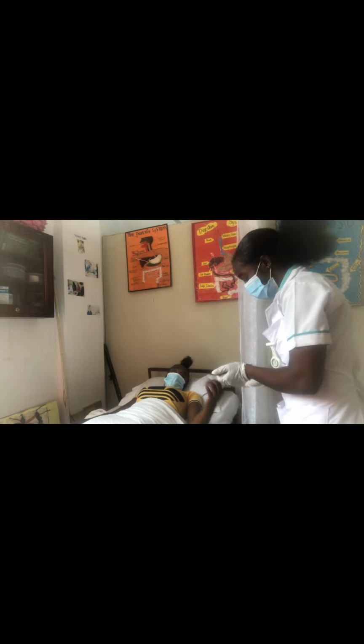Gave her the cotton to apply pressure. And the reading was normal. It was 6.5 mmol. I went to dispose of the sharp hazard in the biohazard bin. Also dispose of my gloves.